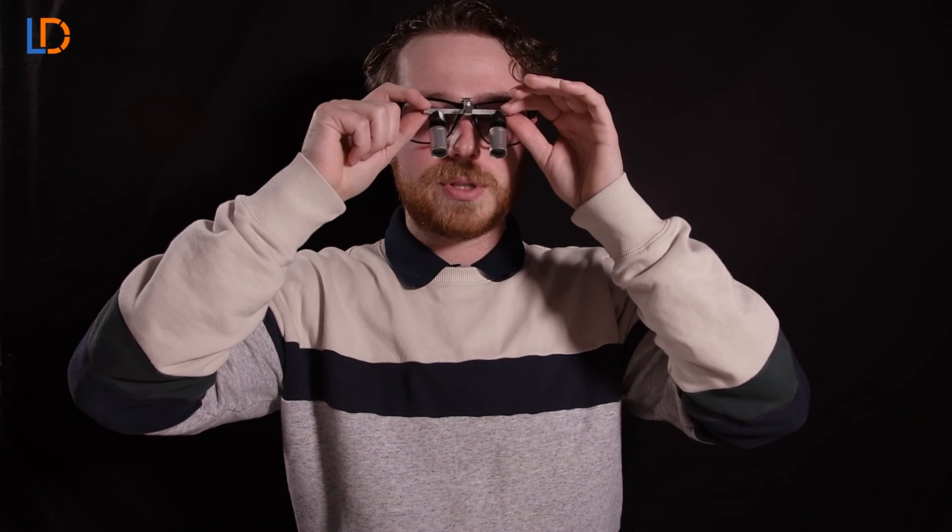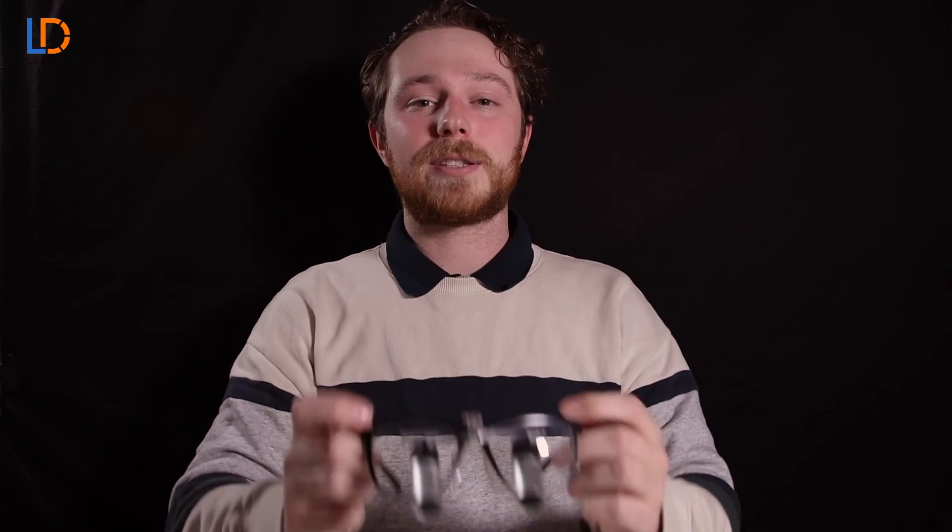And once that is done you can tighten up any loose screws and your Vario Loops are now all set up.